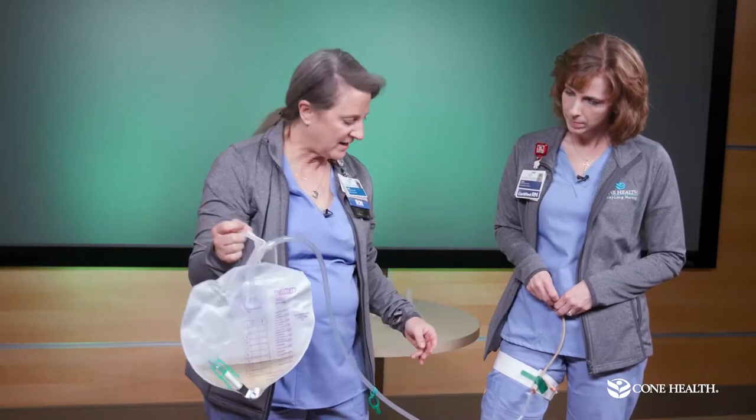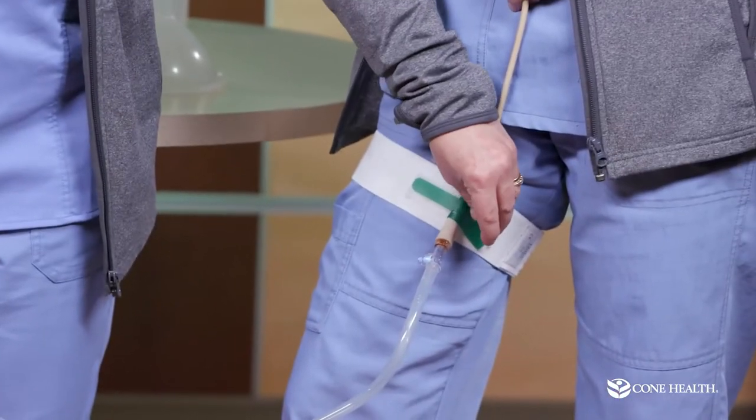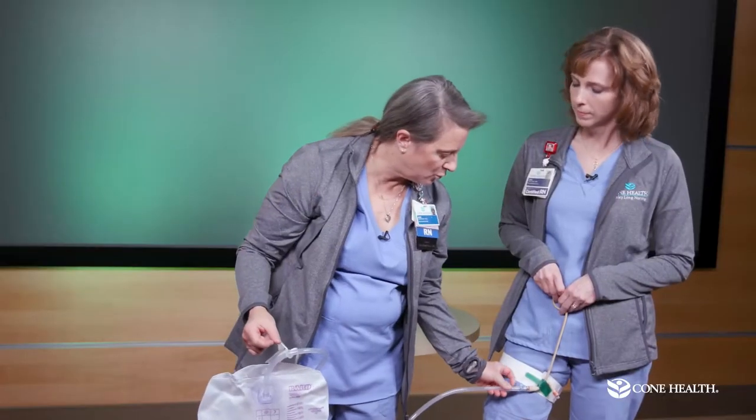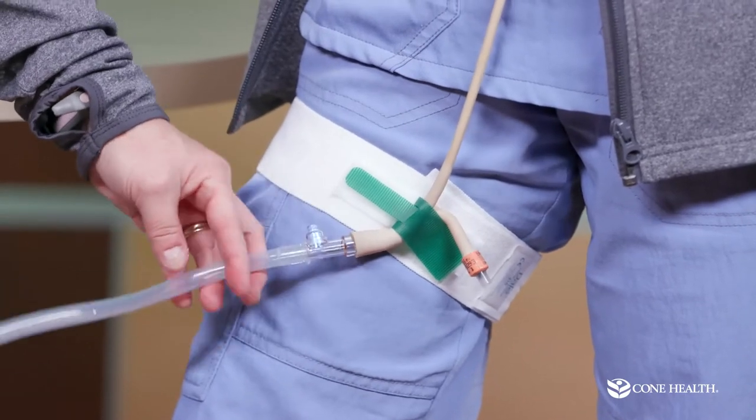The Y port on the catheter is not something you need to worry about at home. The blue port is where we draw specimens in the hospital, so you don't need to worry about that either.